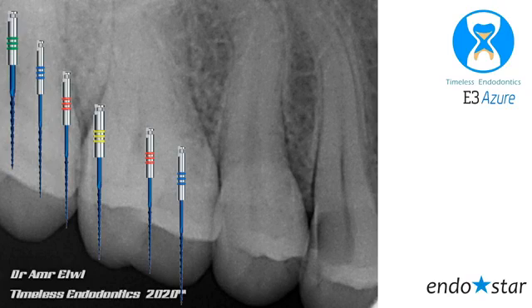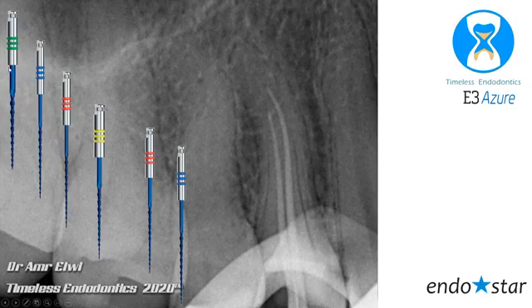So what I'm saying here, I know we can say there are 4 files, but what benefits do I get from this? I finished in less than 30 minutes. Okay, maybe I'm a little bit fast, but later on you will be even faster than me. So what do I get from using 35 as a first file? As you see, when I used 35 and 30 as the first 2 files, I only went this far from the first minute. So what benefit is there from here?